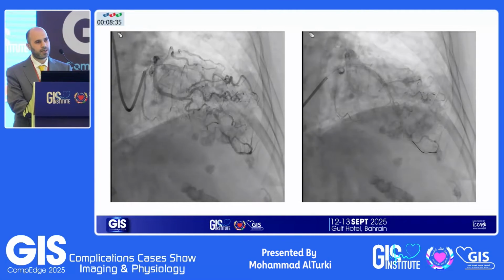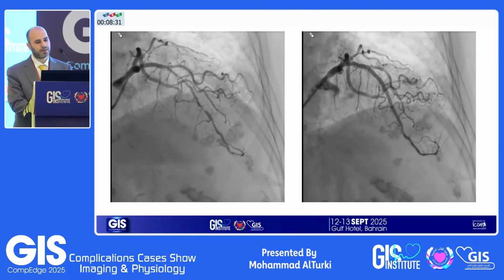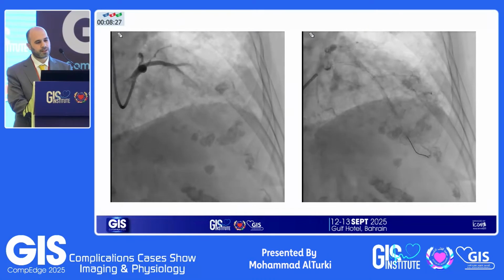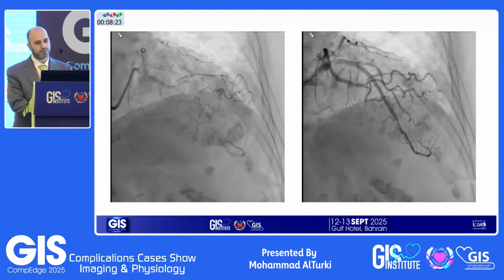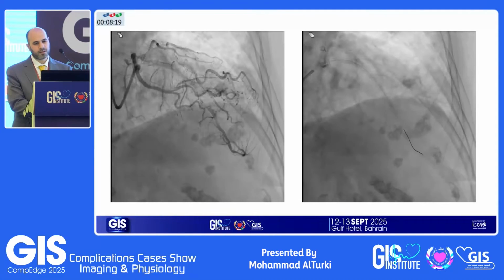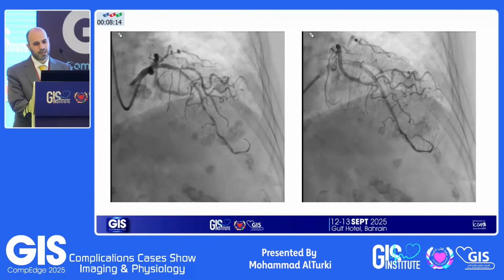There was a minor hiccup in the cath lab when advancing the OCT catheter into the LAD. There was prolapse into the circumflex artery. I don't have any fluoroscopic images of this happening, but we were able to advance the OCT catheter, performed shockwave, and then stented the LAD.